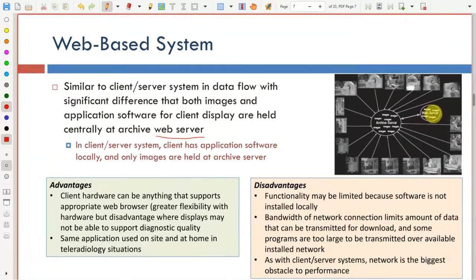This is very effective, because sometimes the application software is very expensive, the applications that the doctors use to diagnose their images. So it might be a very good idea to have it like this, so that they can work on it without having to buy a personal license. They are working through the hospital license for that software, for example.